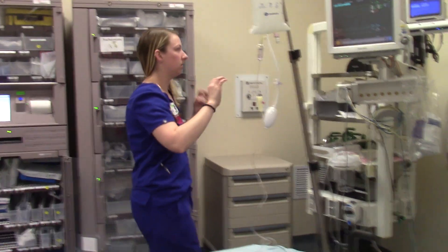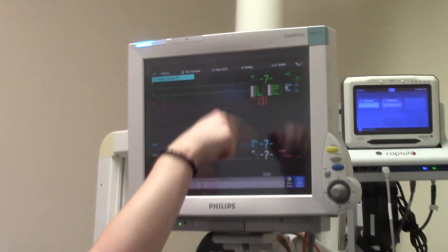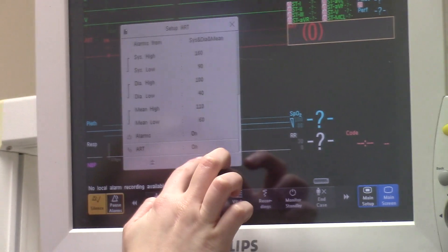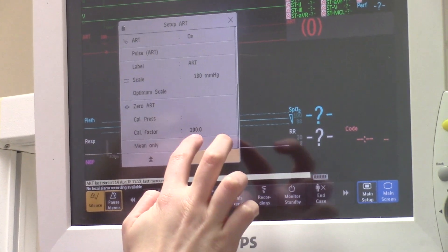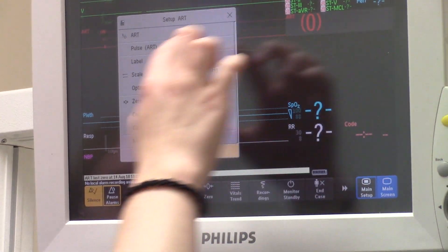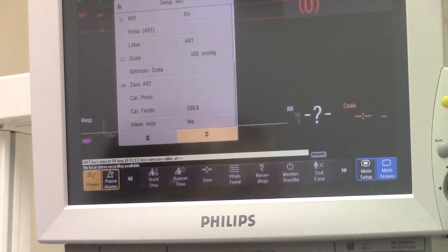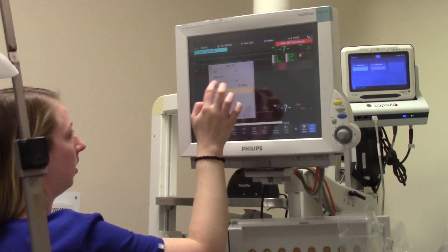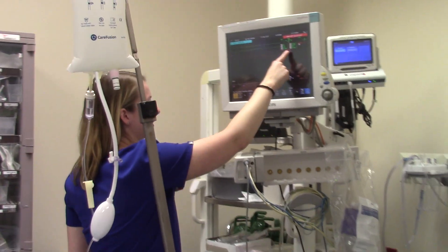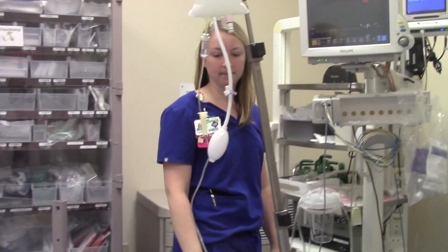At that point, since this isn't hooked up to a patient right now, you should have a nice sine wave showing a pulse on the monitor — one that correlates with their heart rate. You may also need to optimize the scale so you can actually see the waveform better. To do that, click on the art line display and scroll down and hit optimum scale. Right now it's going between zero and 180 millimeters of mercury — if their pressure is much lower than that, this will make the scale smaller so you can see the waveform better. Then it should display your systolic and diastolic pressure readings.